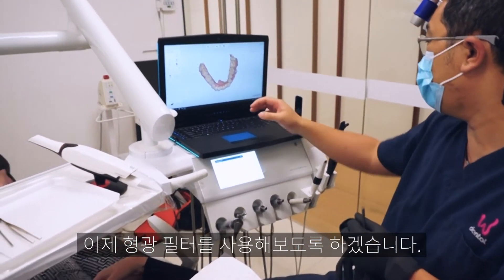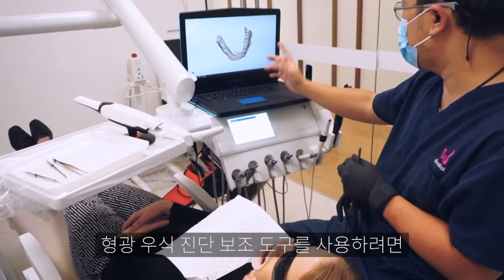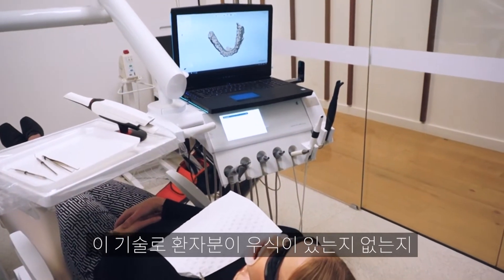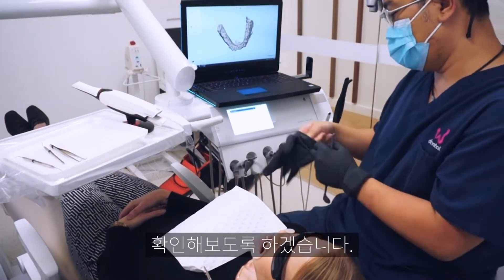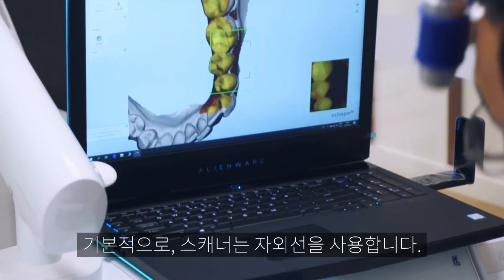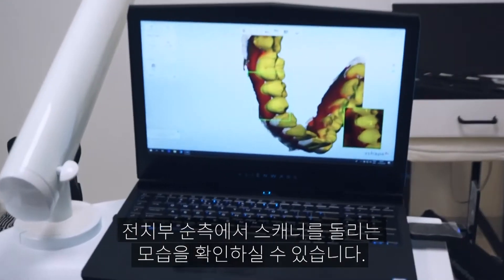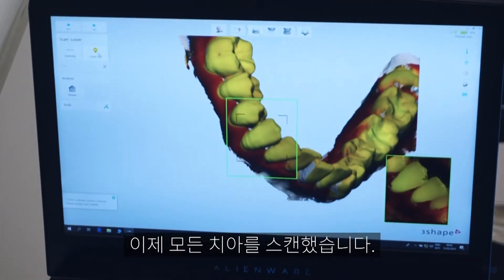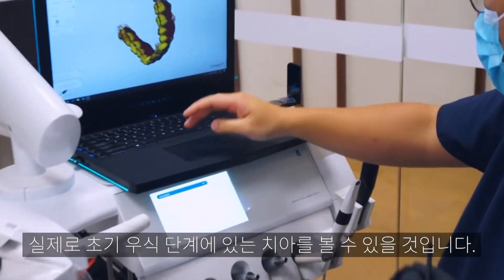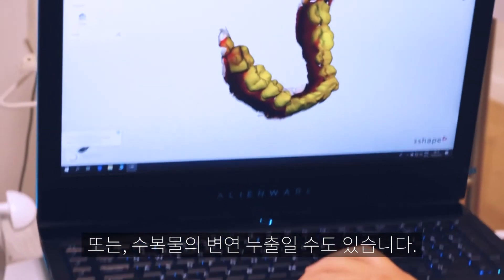Now we're going to try the fluorescence filter — the fluorescence aid or caries aid. We're basically going to scan over the existing teeth to see whether Naomi has any caries or not. Looking at this area, we may have actually found a little bit of early decay or leakage of a restoration.